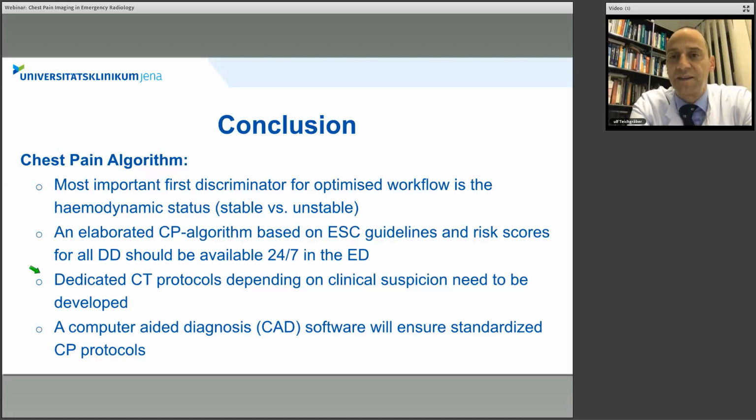And there we really do not care so much about the dose, as we have already enlarged the window and usually also try to do the whole aorta, because we also have to rule out aortic syndrome, and therefore answering the clinical question is much more important. It is more important to get good image quality in these patients, because we usually don't do them with beta blocker and nitroglycerin, and therefore we always do a multi-phase in triple rule out patients, or dual rule out.